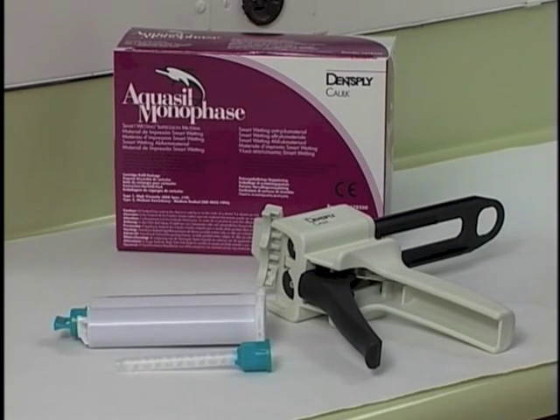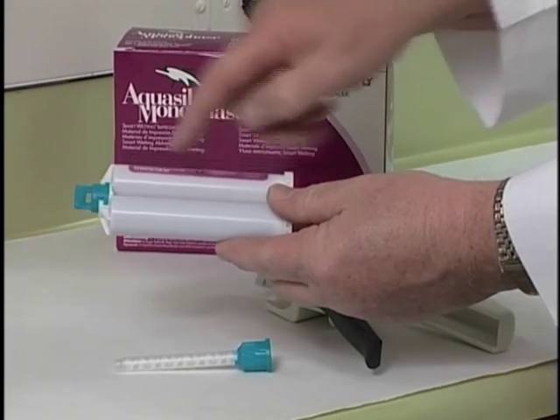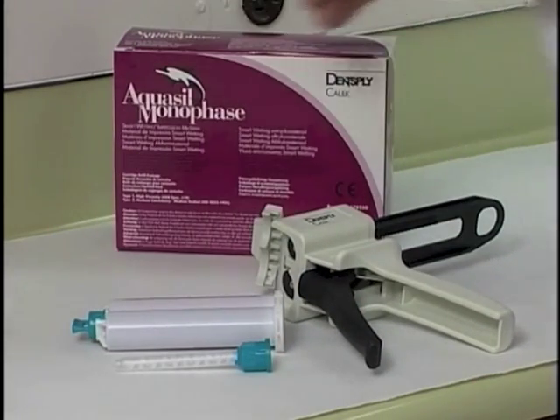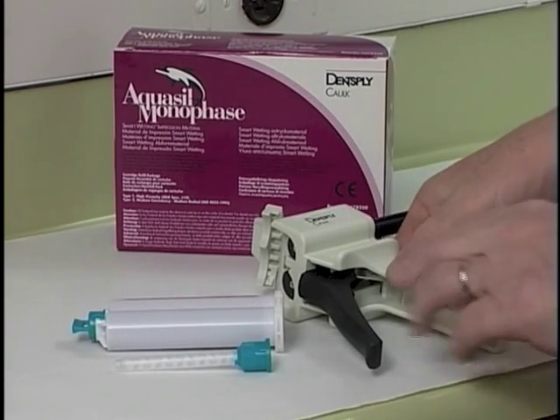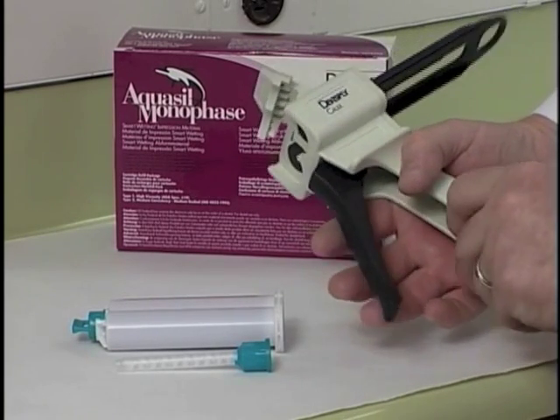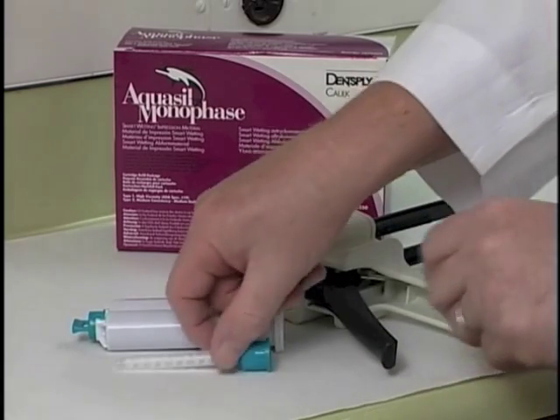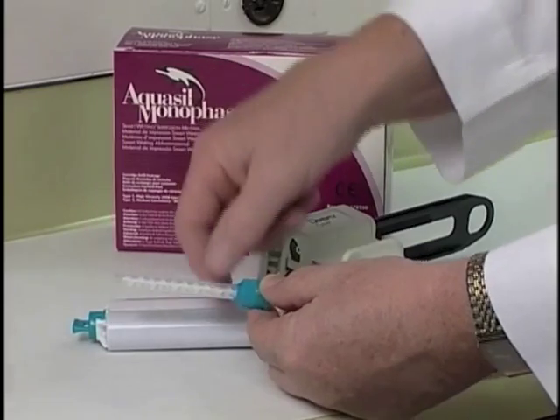The apparatus that is used for mixing and dispensing the polyvinyl siloxane with Aquasil consists of some tubes of the material, which must be thoroughly mixed, one portion of the material with the other portion of the material. This cartridge is put into a dispensing device that's much like a gun, that when we have it loaded we can squeeze this handle and it will dispense the material, mixing the material through an auto mixing type of tip.